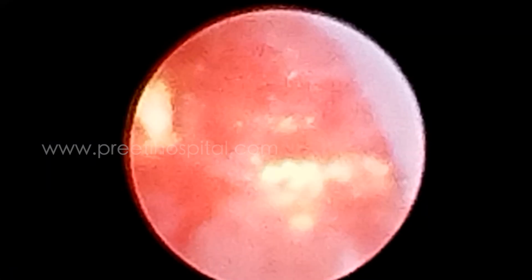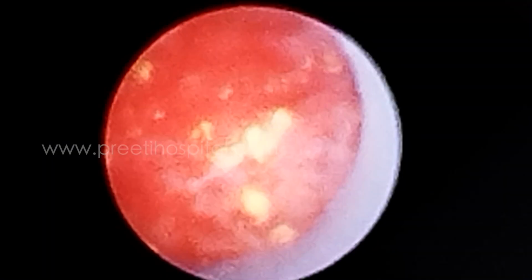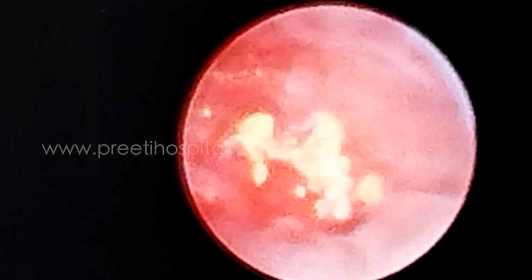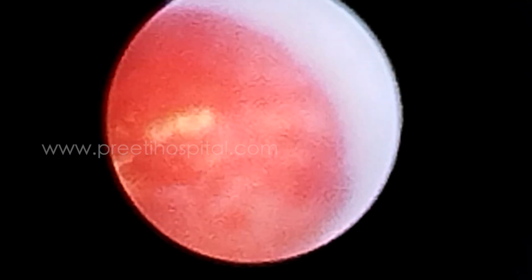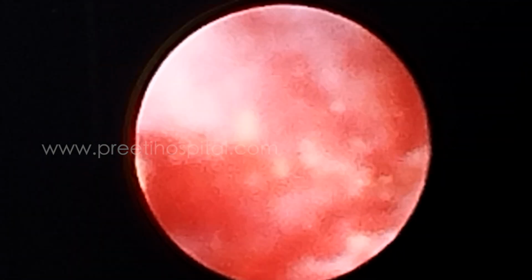Withdraw the ureteric catheter and go below. See how I am adjusting? Yes, sir. I am doing these movements so that the stone flushes. See how the stone forms coagulum in no time. So what you should do is have patience, go close and nicely remove like this. Okay? Otherwise they usually pass off in the urine. These things can form nidus for new stone formation.